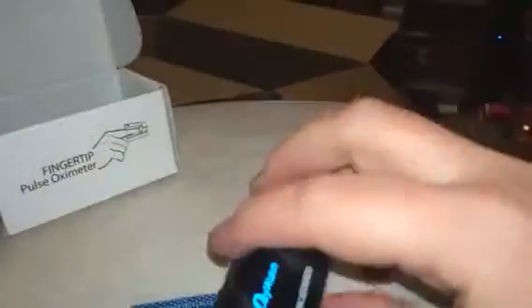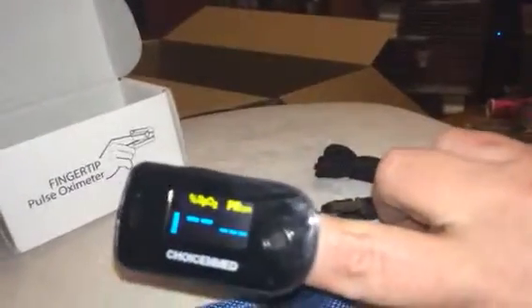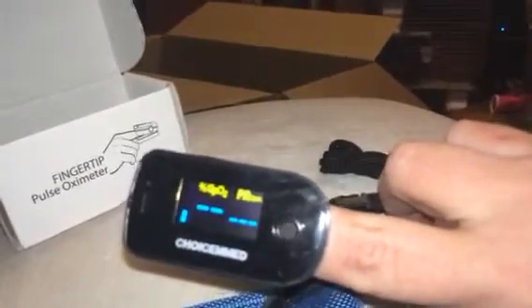Then you'll just turn it on, and it goes right on your fingertip. I'm doing it the wrong way — it goes on your fingertip, and as you can see, it's reading my pulse there on the side, going up and down.